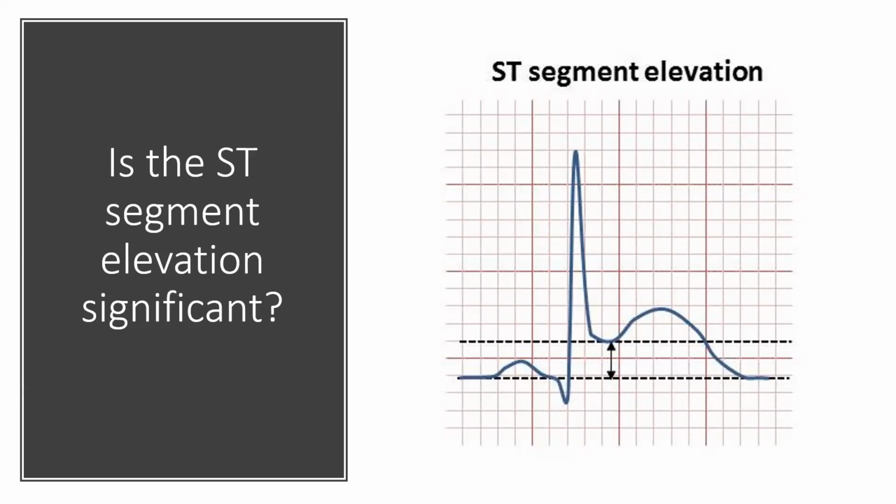True or false? Is ST segment elevation always a sign of pathology? Okay, so here's how you responded. Actually, the correct answer is that it's false.